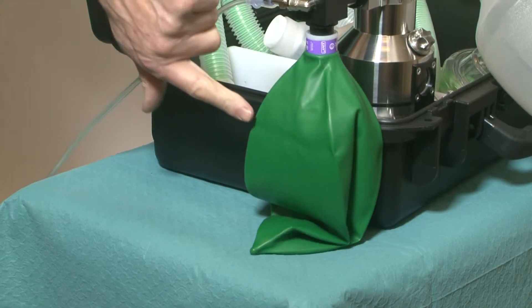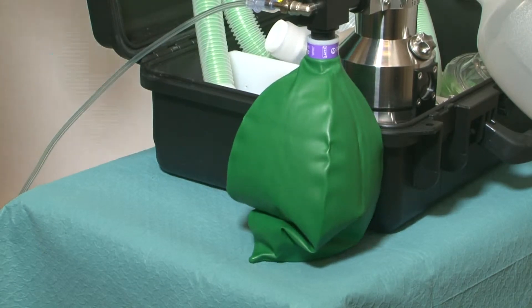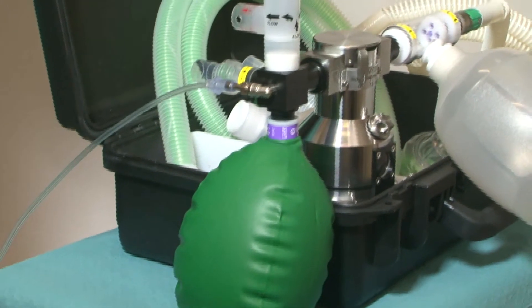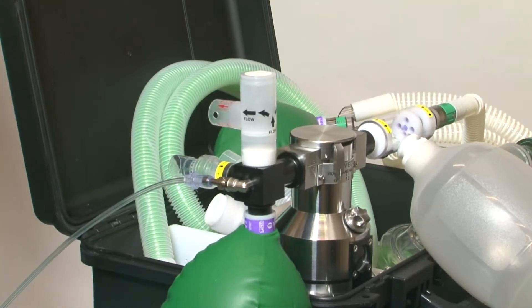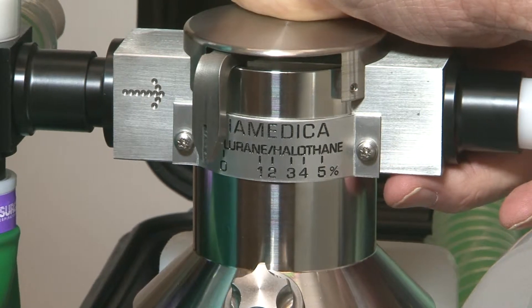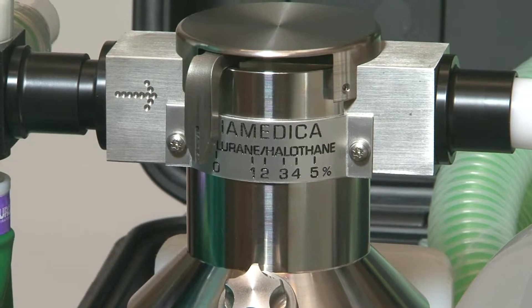If the level of oxygen supplementation is less than the patient's minute volume, the bag will empty. If the oxygen supplementation is increased, the bag will fill and the circuit will become continuous flow. The overpressure valve on the reservoir block avoids excessive pressure in the system. The vaporizer will function in either drawover or continuous flow.